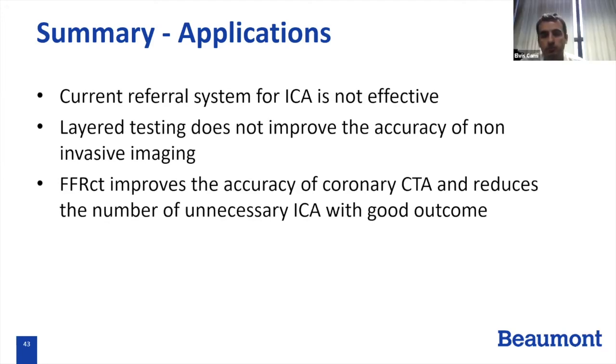Right. So for the last decade, I've told our technologists to do a non-contrast exam before we scan to review the degree of calcium, and if it's horrendous, to stop. It sounds like because you have FFRct, you go ahead because you have this additional tool to get through that.